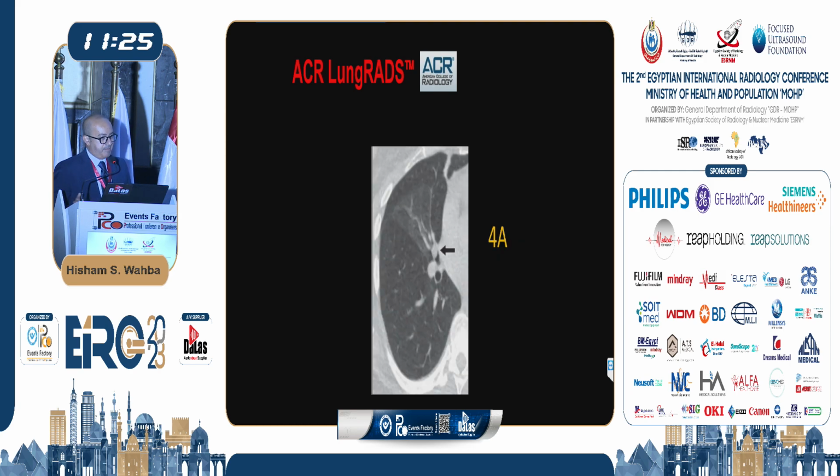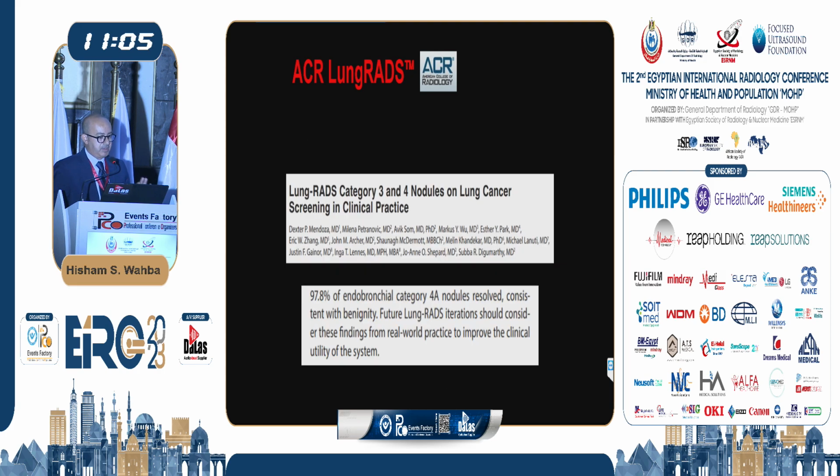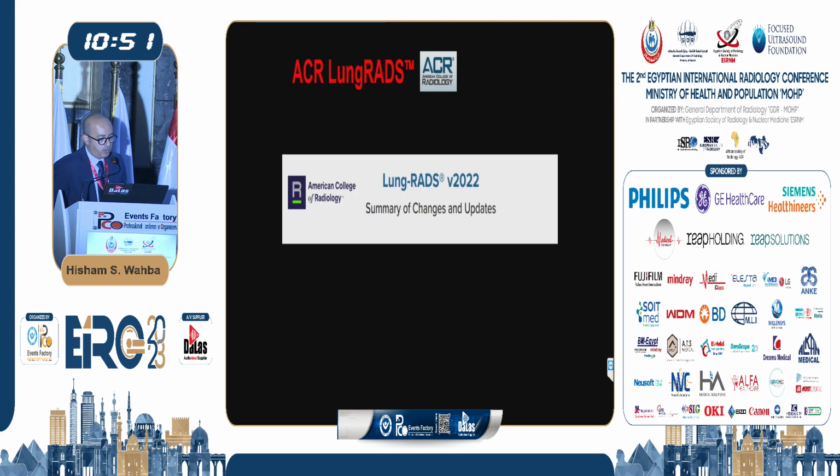For example, the endobronchial nodules were not mentioned in Lung-RADS version 1.0. And for example, this by definition should be called a Lung-RADS 4A. So this is an alerting one. And on follow-up, it completely disappeared. So it may be bronchial secretions, bronchocele, or whatever, and it's totally benign. So that point made them revise the Lung-RADS again. And they found that 97.8% of endobronchial category 4A lesions turned out to be benign. So again, a pitfall in Lung-RADS version 1.0. Lately, in this year or the year before, they came with the latest version, which is version 2022.